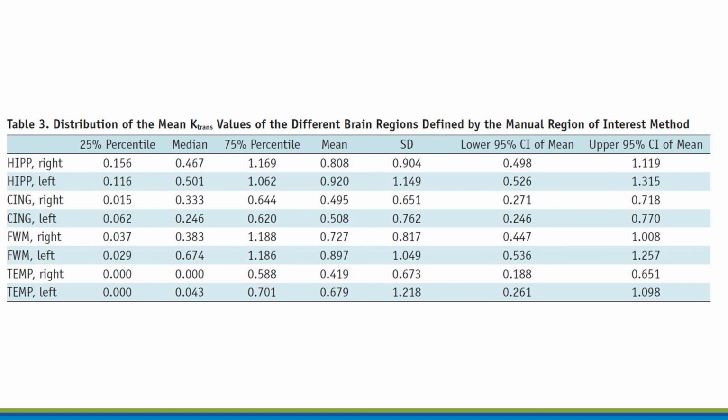The K-trans values of the manually drawn hippocampus were higher than those of other regions, while K-trans values of the automatically segmented hippocampus did not show such differences. Contamination with the choroid plexus or inclusion of arteries during manual ROI selection may have contributed to these high K-trans values.